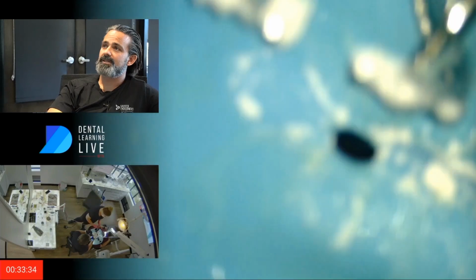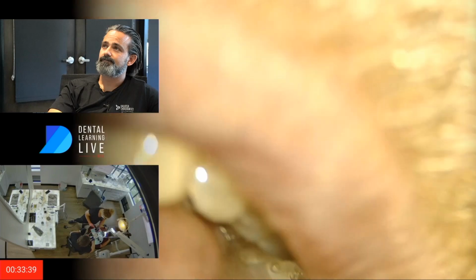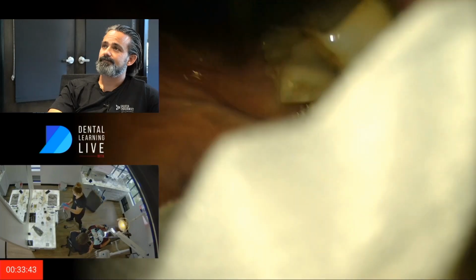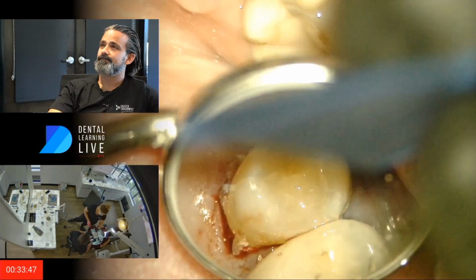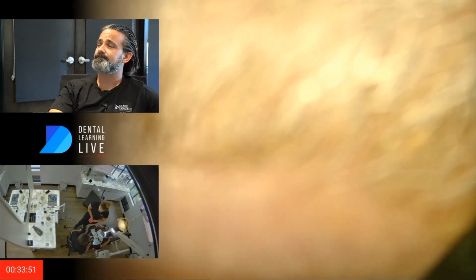Take a look at this thing. Do a little occlusal check.